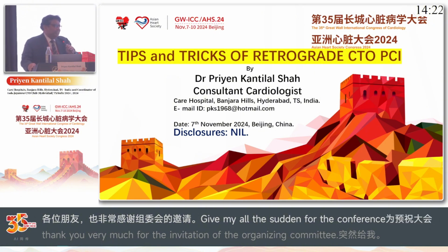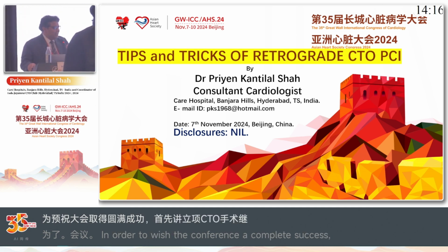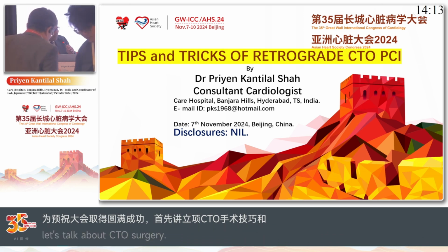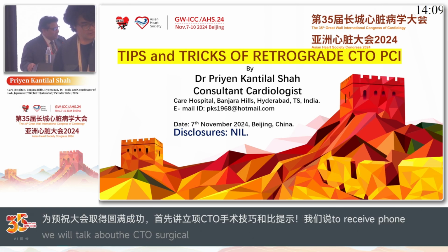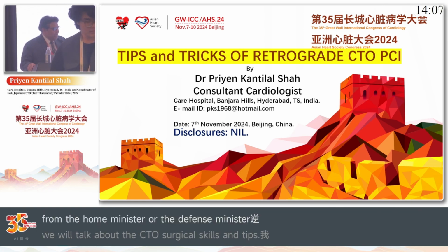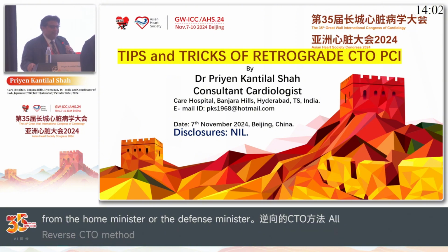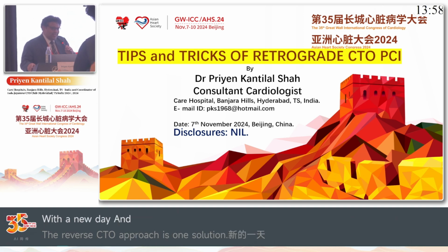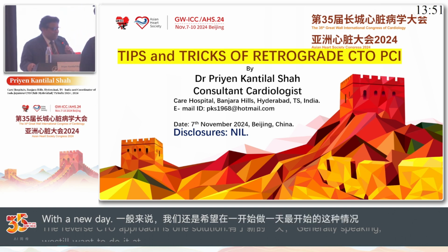Retrograde CTO PCI, tips and tricks. The lecture is the last, but never start the case at the fag end of the day, when you are going to receive a phone call from the home minister or the defense minister asking where are you, why you are late. So always start with a fresh mind, with a new day and a good early start. See to it that your Cath Lab team is also fresh and nobody is in a hurry and bury.